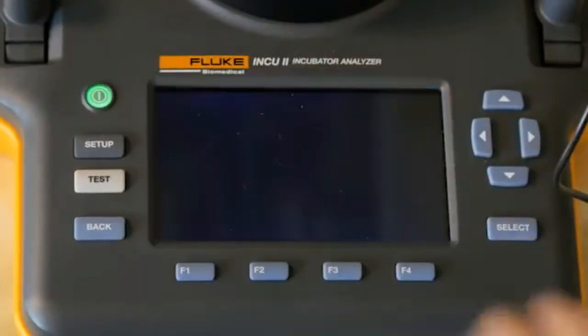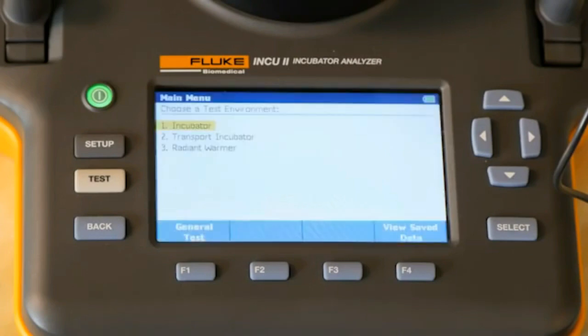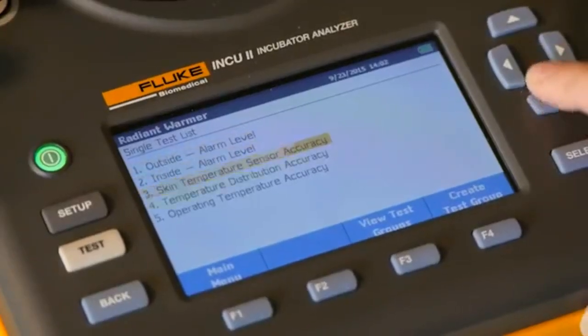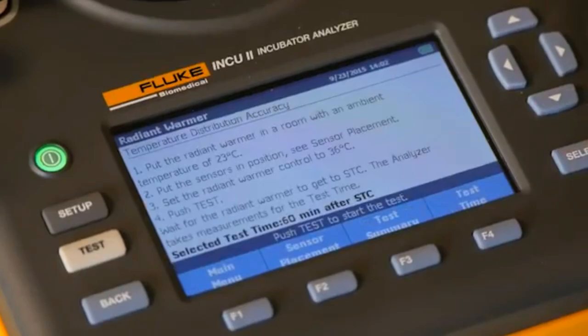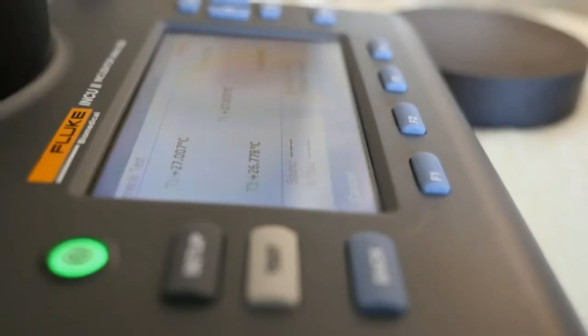The large LCD screen of the Inq2 displays real-time test results, along with pass-fail indicators. You'll appreciate its standard and customizable test templates, which support automation making it easier, faster, and more convenient to conduct tests.